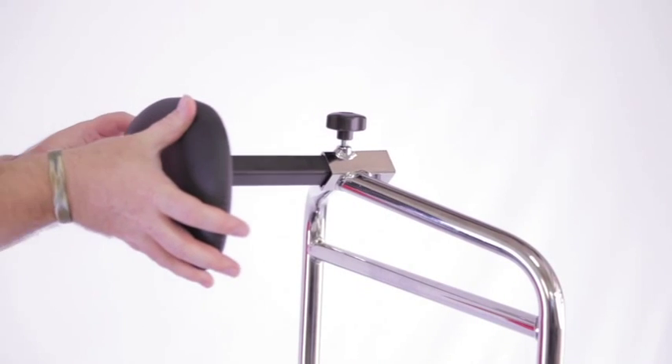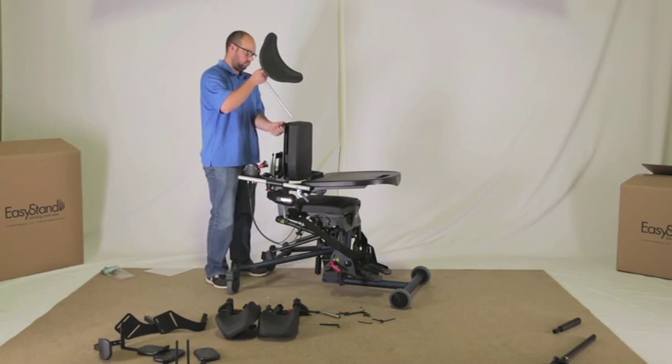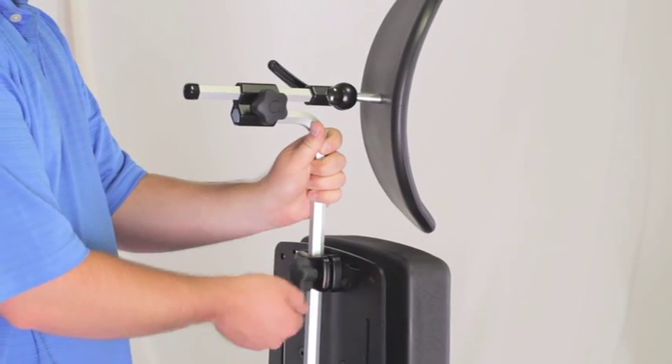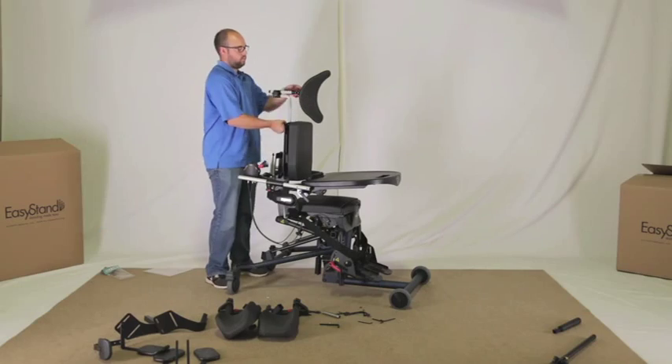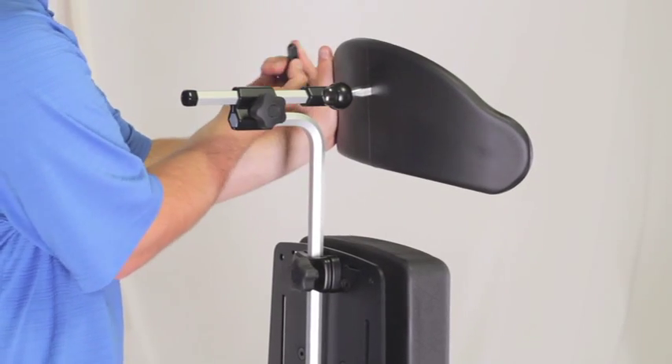For the no tray option, insert the chest pad bracket and tighten securely. If a head support was ordered, loosen the knob and insert the head support. Tighten securely. Put the pad into the desired position and tighten the knob securely.